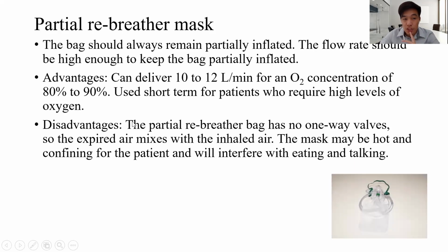The disadvantage compared to the non-rebreather mask is that there is no one-way valve, so the expired air is able to mix with the inhaled air. And like in the low flow therapy, the mask is hot and confining. So it will interfere with eating and talking, and also might cause claustrophobia.